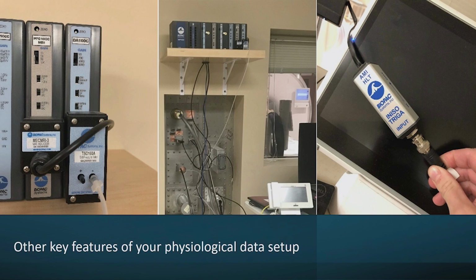Okay, so these are other parts of the setup. Again, I talked about the PPG and respiratory transducer setups, and then we have the patch for going into the scan room. Typically you have all these wires going in there. One of the key things with a lot of physiological data collection is how the wires are threaded through the MR patch and into the scanner. As you can see, hopefully, the clear cord is the respiratory belt cord. That is how you're measuring the changes in pressure.